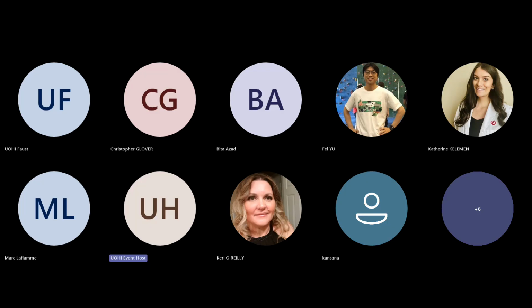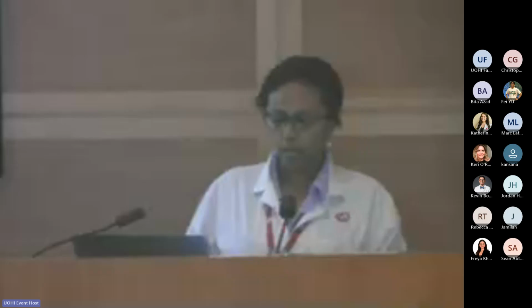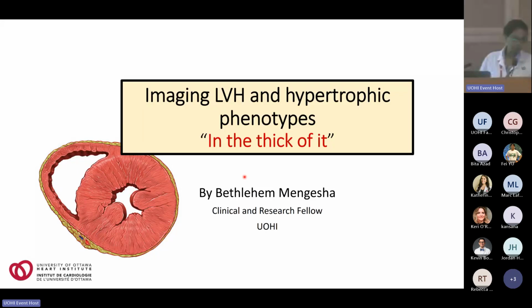So thank you for joining me on today's talk, which focuses on the role of imaging in diagnosing LVH, hypertrophy, and its phenotypes.